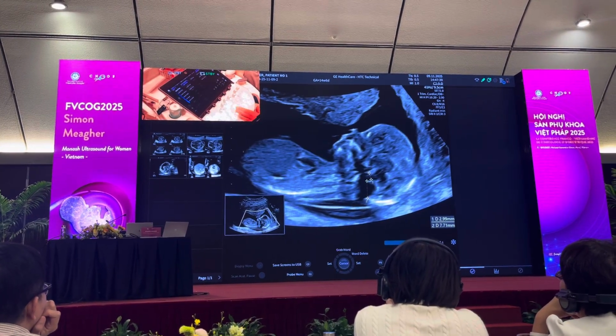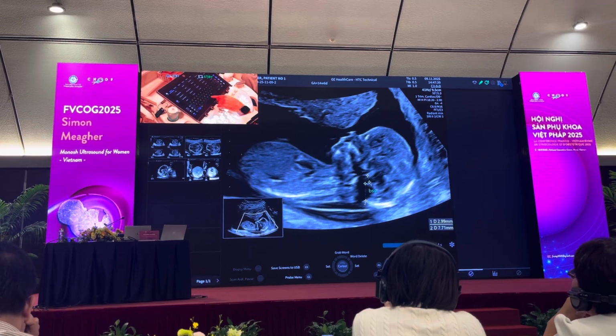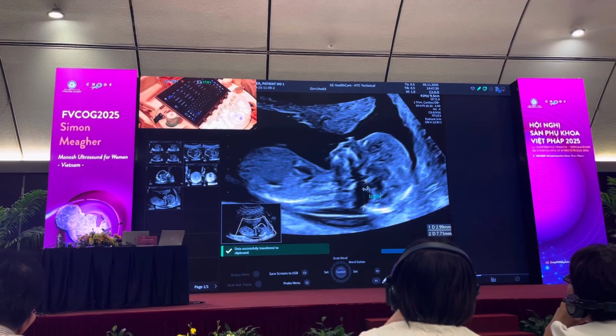is increased. This is called the BSOB distance. So that's the first thing that strikes me when I'm looking at this section, the BSOB is increased. I save that image to the file.